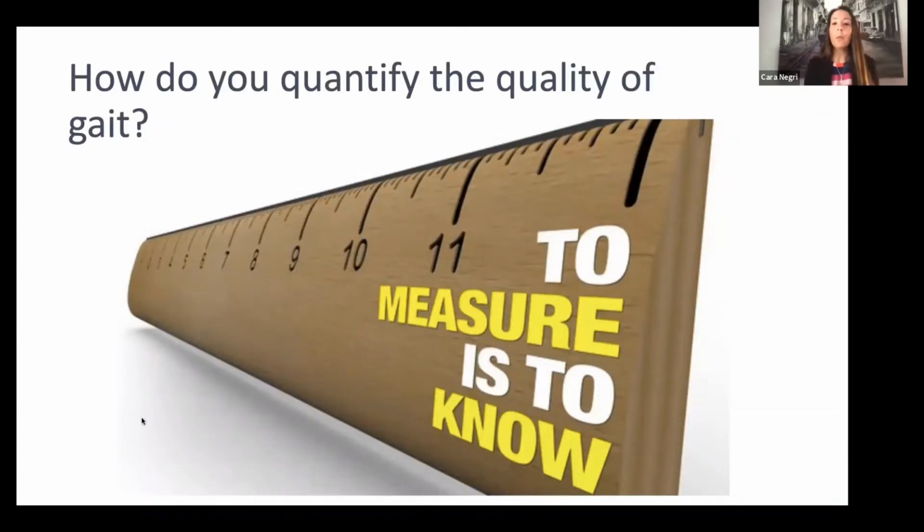I'm going to show you about this program today, but I want you to consider that you can download the score, get the original study, and just use your video on your phone to start to quantify gait. You don't have to have any fancy equipment, and that's the great thing about these smartphones and how fast they've progressed, that we can all take pretty good video with what's in our pocket.